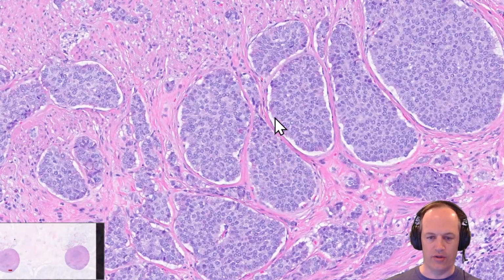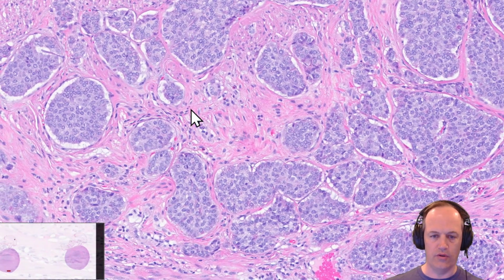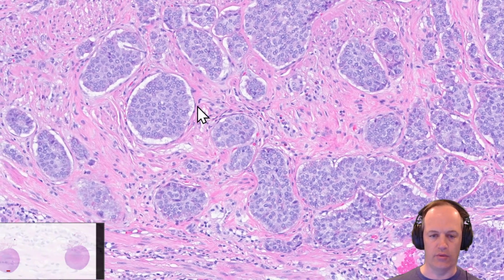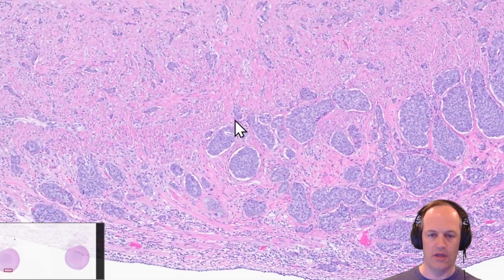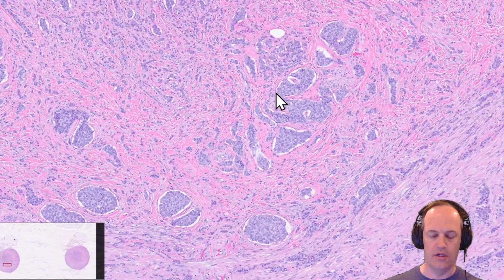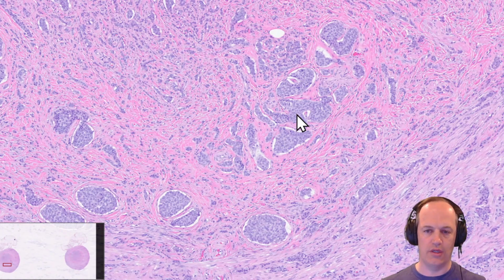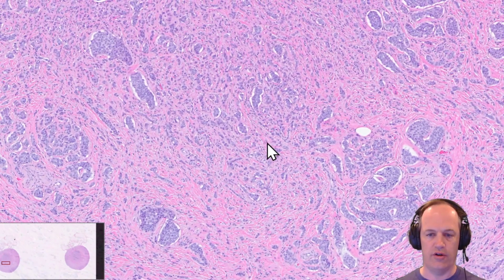Very good. You've even got the correct terminology. These used to be called carcinoids, but the current term is well-differentiated neuroendocrine tumor. And so you want to know the margin status for this, and go look at the most recent edition of the AJCC for the really detailed staging information about these, because it changed a little bit. The most important thing to know about these, particularly in kids, is the margin status, because if they don't get to that ink at the base margin, the surgeons are probably not going to do anything else for this kid. That kid is cured, this tumor is gone.